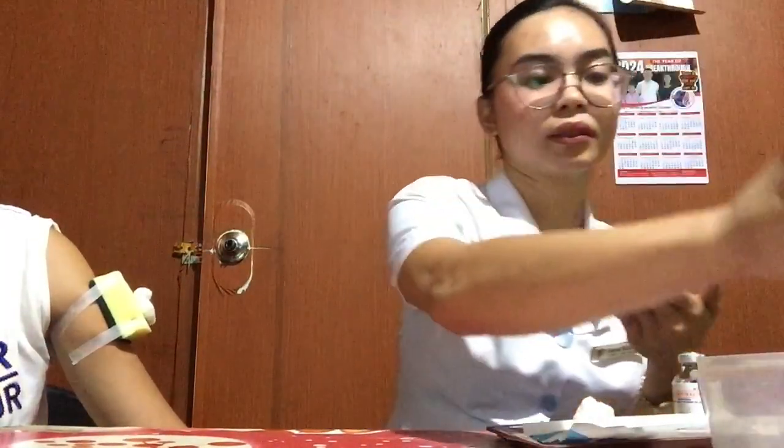Discard. Then sanitize our hands. And that's all for my return demonstration.